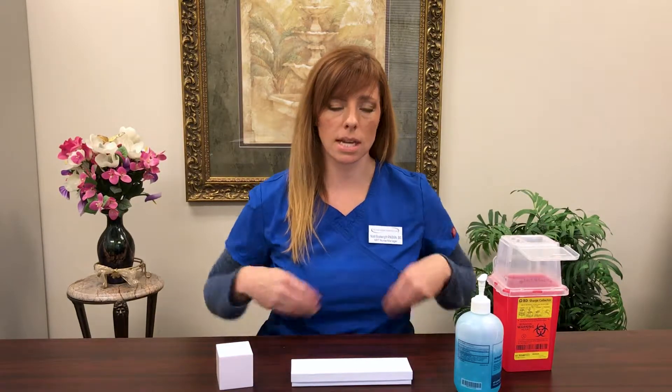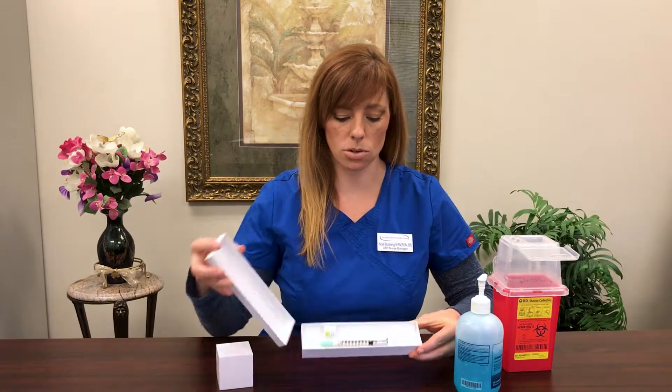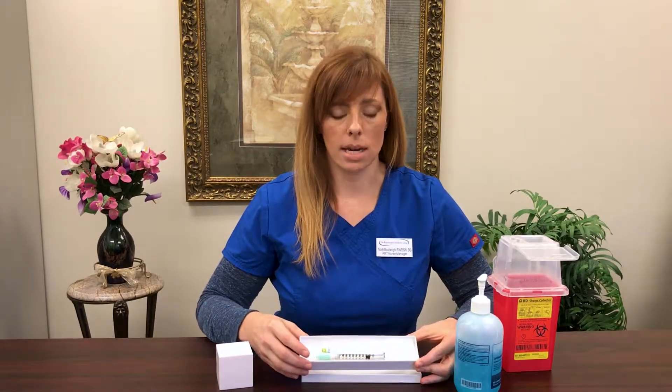This is going to come in a pre-filled syringe. There's no mixing, no dosing — there's nothing you need to know other than how to give this shot to yourself. This particular syringe came from a pharmacy in what looks to be a jewelry box. Yours might come in something that looks like a toothbrush holder, and you would just open it end to end and be ready to go.